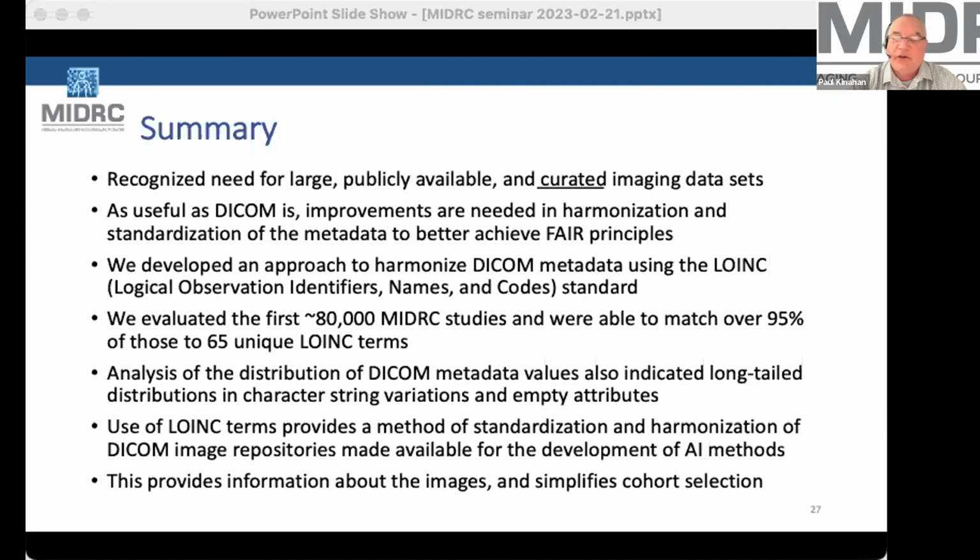There are ultrasound images, PET images, MRI, you name it. We even got some bronchoscopies, and so probably somewhere in there are gynecologic images. To find those might be a little challenging right now, but it's not out of the question. It might take some digging. Later, as we expand the curation efforts, we hope to be able to identify everything.